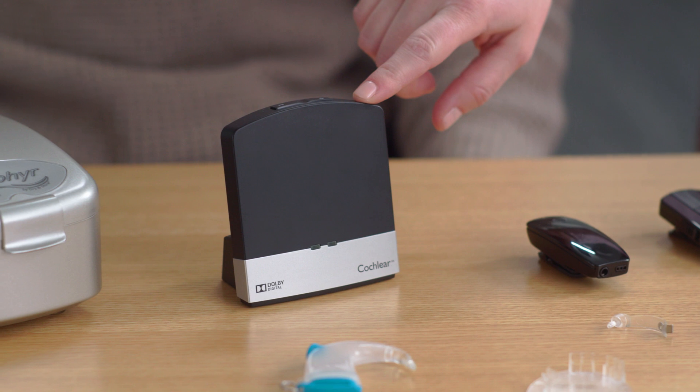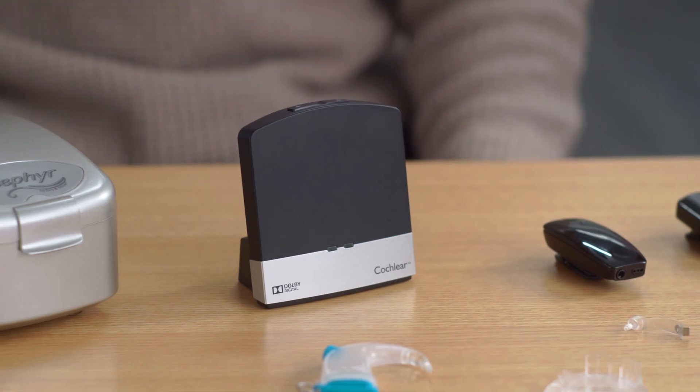Think of the MiniMic 2 Plus as your extendable ear up to 82 feet. The Cochlear Wireless TV Streamer is great for households where more than one person may be watching TV. The benefit is the TV Streamer allows you to hear the TV directly through your processor at your own comfortable volume, while other viewers in the room listen at their preferred volume or not at all.